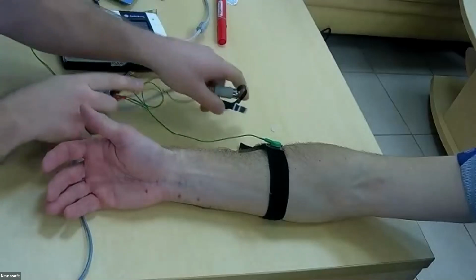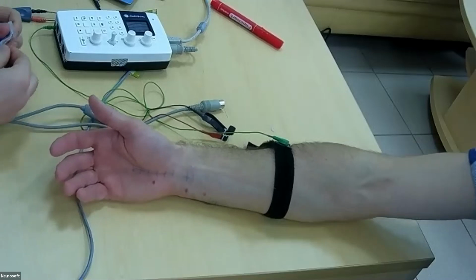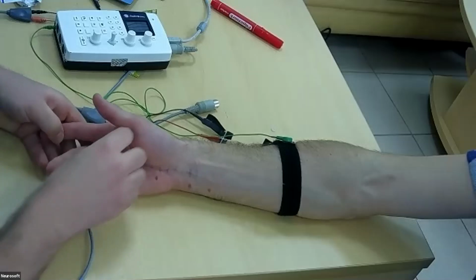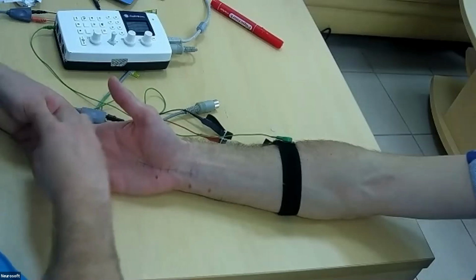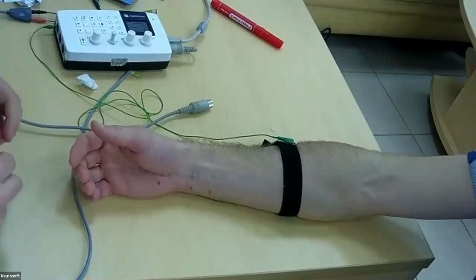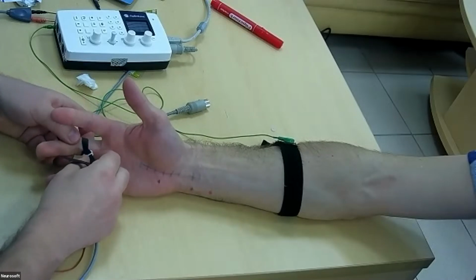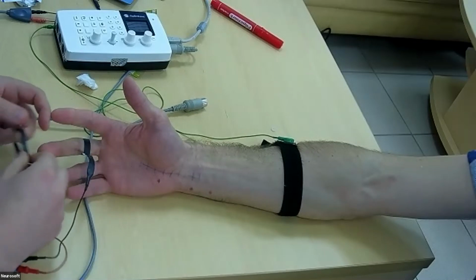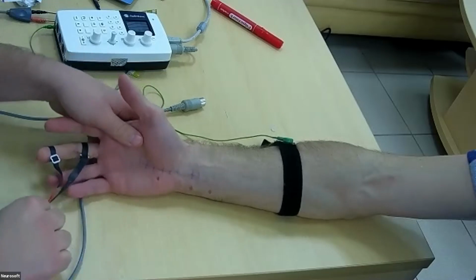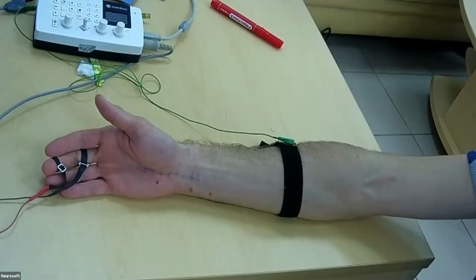We should prepare skin with alcohol, swab up a little skin, because we set the active electrode more proximal and, as usual, the reference more distally, as for any sensory nerve study.